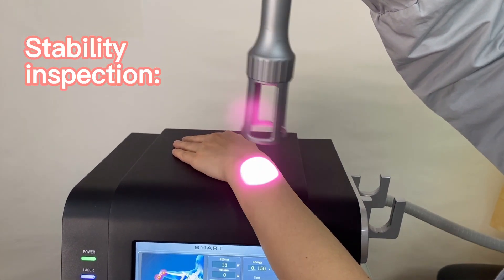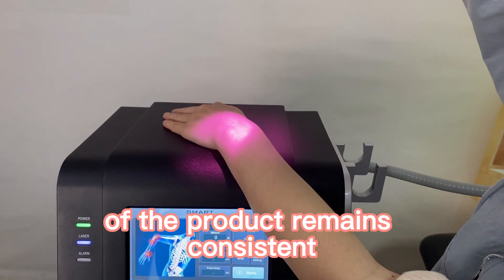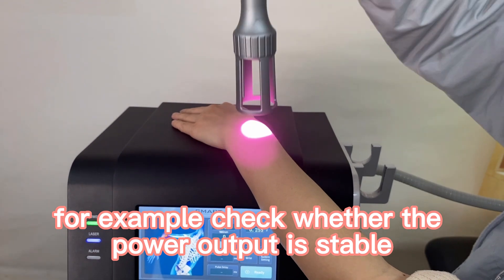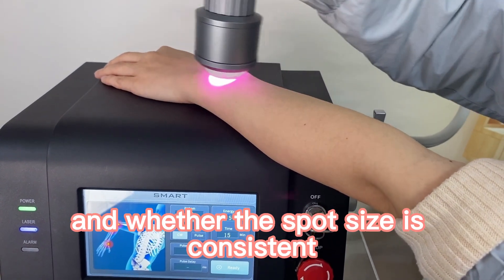Stability inspection. Check whether the performance of the product remains consistent after multiple uses. For example, check whether the power output is stable and whether the spot size is consistent.